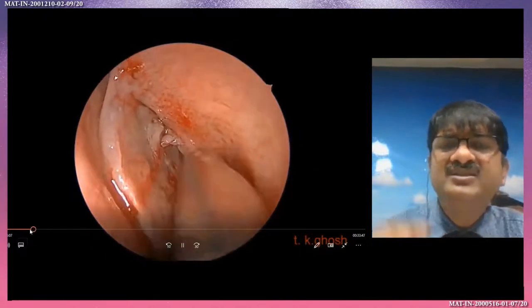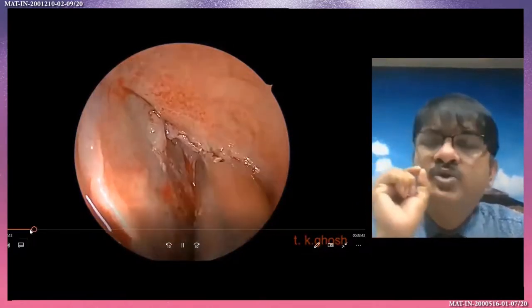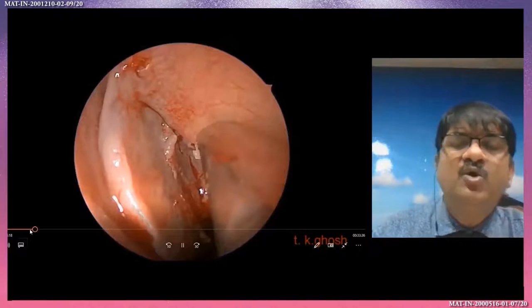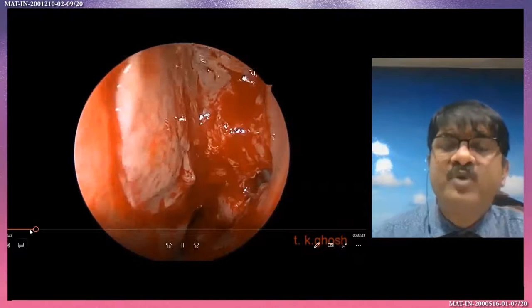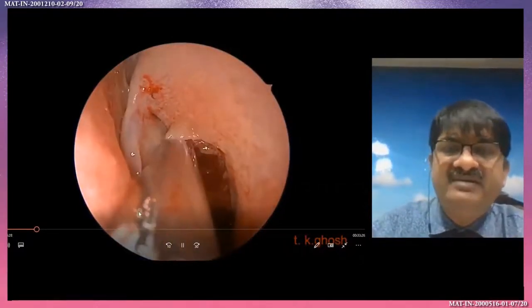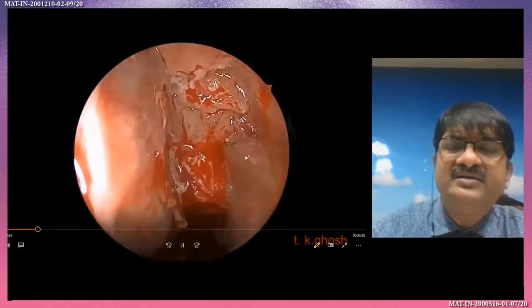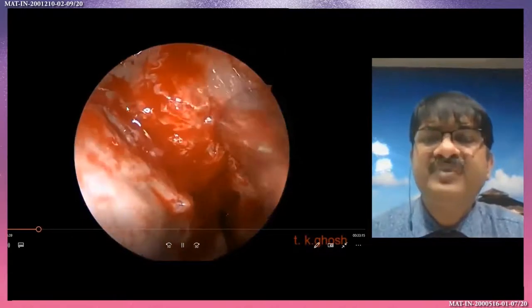Clearly, just the extreme upper part I am preserving — when I will do the frontal sinus surgery then I will do that part. Otherwise all parts of the uncinate are carefully removed to properly see the bulla ethmoidalis. Here medially the middle turbinate, laterally the orbit, and mostly the bulla ethmoidalis.